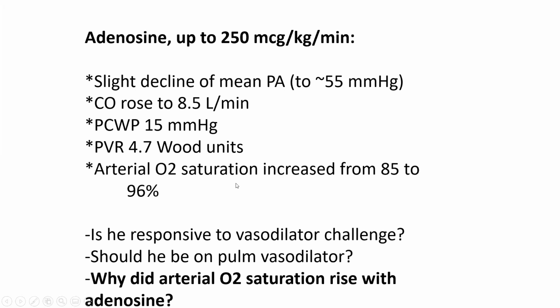Okay, that's one way of telling, well, this is not Eisenmenger here. She's not having severe PAH and right to left shunt from a prior old chronic left to right shunt and Eisenmenger syndrome. It was so easy to reverse that PVR and shunt. That's an indirect cath hint. Of course, by echo, you can prove that there is no true shunt. There is no large ASD or large VSD.